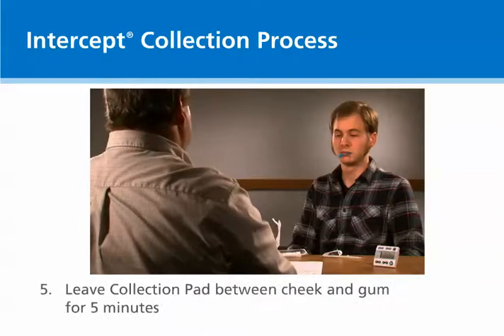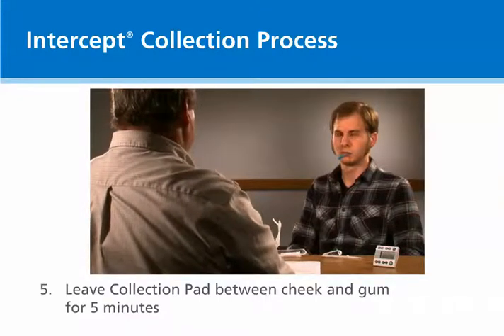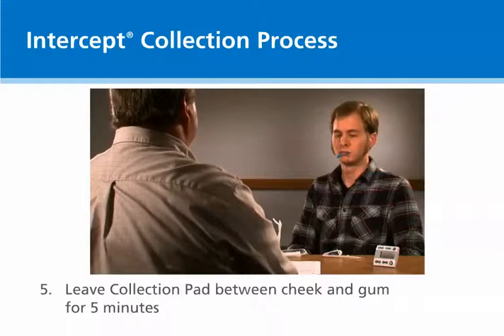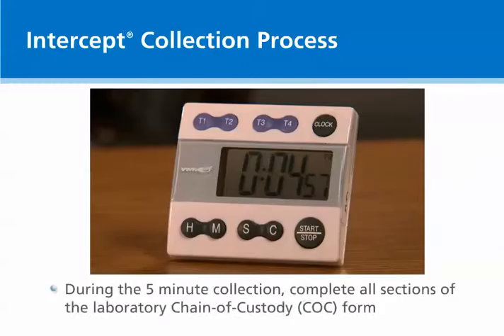Once moist, leave the collection pad between the cheek and gums. Be sure the blue flag is pointing up. Begin timing. During the 5-minute collection, complete all sections of the chain of custody form.